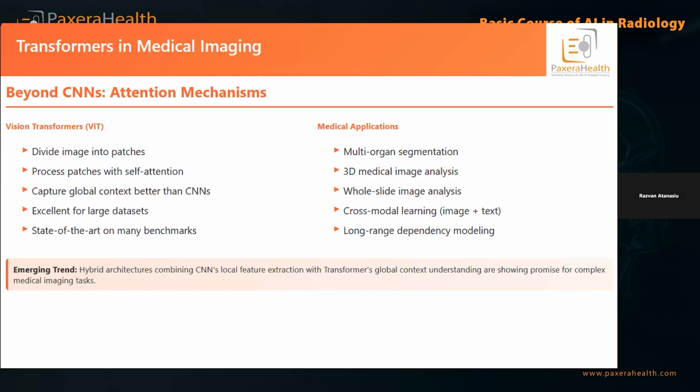So these models actually capture global context and deliver state-of-the-art performance in tasks like multi-organ segmentation and 3D analysis, right? So transformers are now used as well, and they have some advantages.